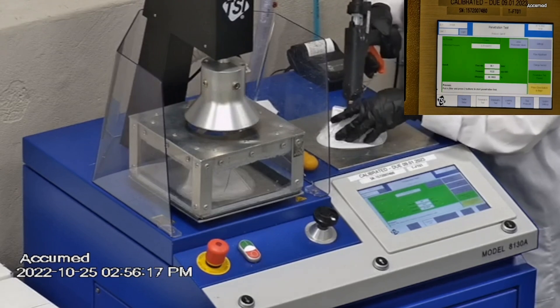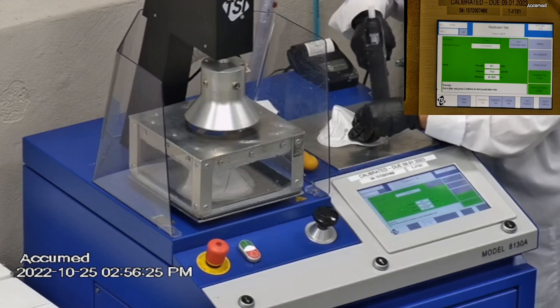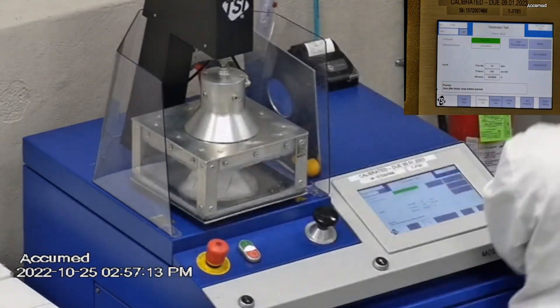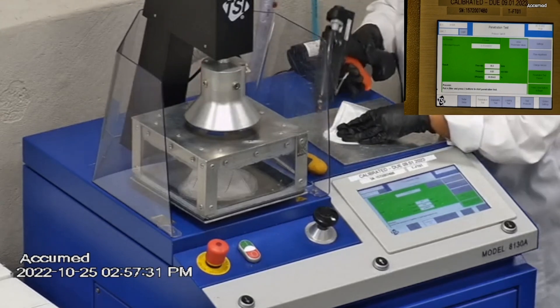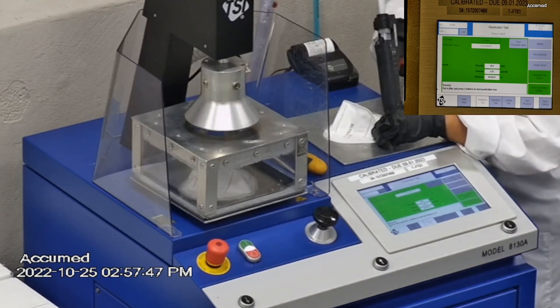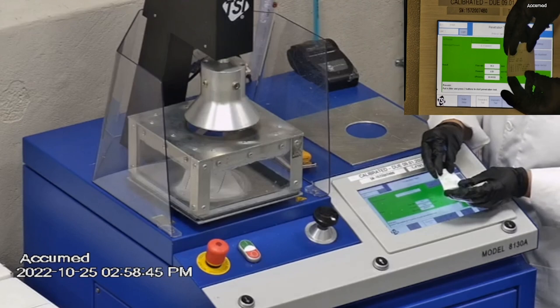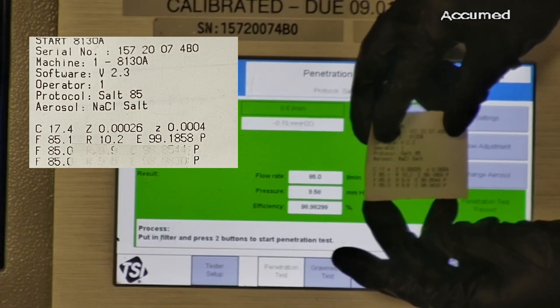The first sample tested at 99.19% filtration efficiency and a pressure drop of 10.2 millimeters of water. The second sample had a filtration percentage of 98.85% and a pressure drop of 9.8 millimeters of water. The last sample had a filtration percentage of 98.98% and a pressure drop of 9.8 millimeters of water.